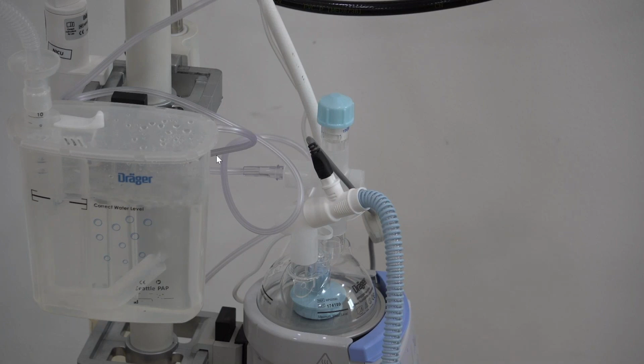PEEP is positive end-expiratory pressure. We've all got PEEP, and physiological PEEP is 5. By giving CPAP, you're just supporting that PEEP and allowing for gaseous exchange, if that makes sense. So we all have PEEP. Most babies need a bit of help to support their PEEP, and that's what CPAP does: it maintains that PEEP and gives a bit more to just keep it open and allow for gaseous exchange.